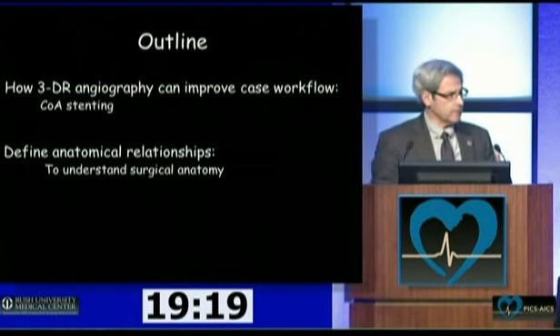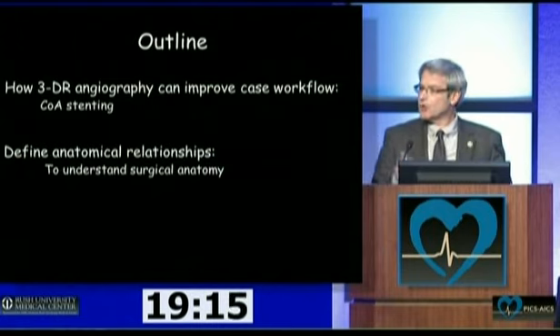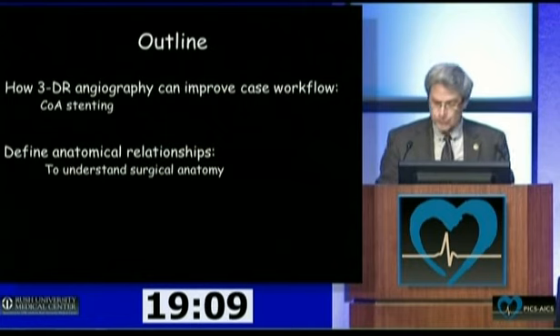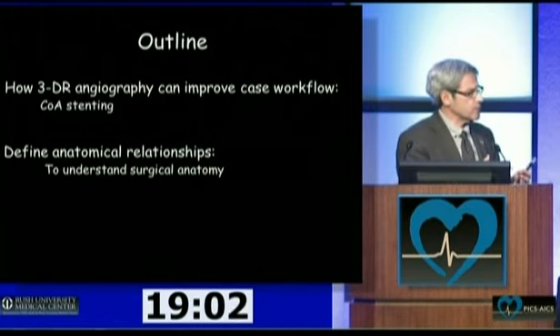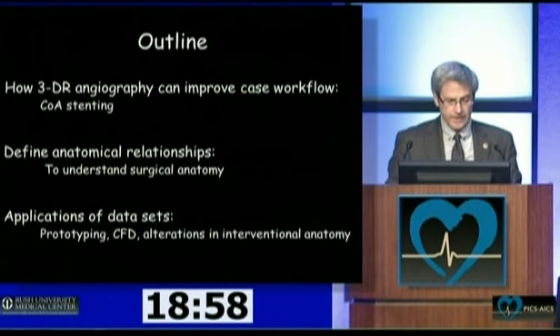And then I thought I would touch upon some anatomic things that you can learn from three-dimensional acquisition to understand surgical anatomy and change, perhaps, the way the surgeons do an operation based on demonstration of relationships that you can't see by two-dimensional angiography.